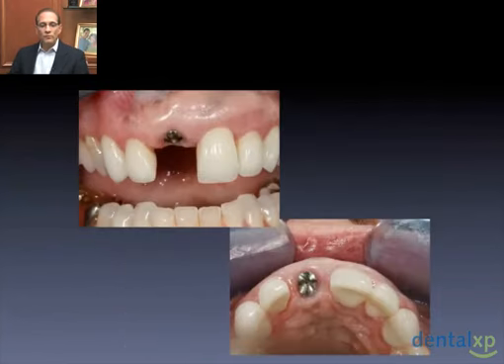So here's a situation where the implant's been placed. This is a traditional healing time. So the patient has had the implant placed. Time is osseointegration has occurred. The patient presents back to me 3-4 months later, and this is what we present with.